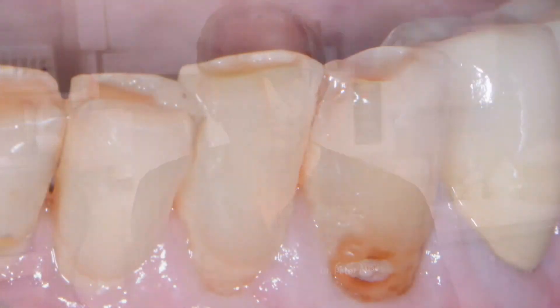The beauty of Omnichroma is you're always using fresh product because you're only using one shade. When you first place Omnichroma on a tooth, it looks very opaque — very, very white, like it doesn't belong — but after it's manipulated and after the light hits it, it blends with every tooth that you see.